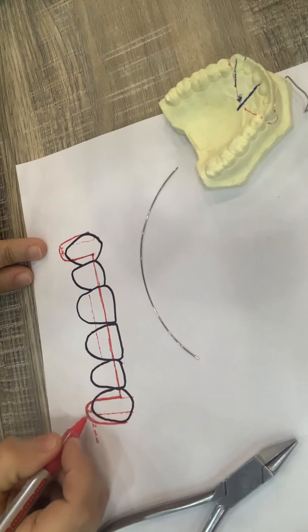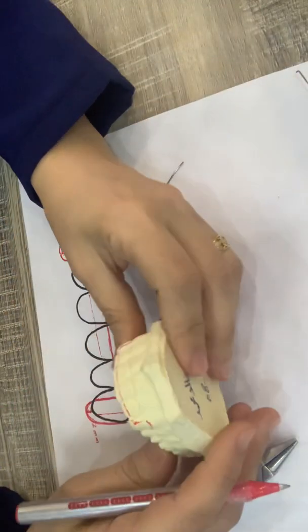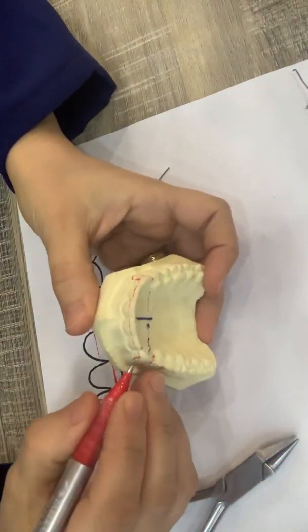Okay, the U-loop should be 2 mm from the gingival margin of the canine. So we draw it on the cast.